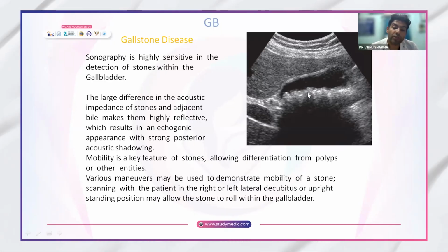So these are all gallstones which are within the gallbladder lumen, and these are mobile stones. So once you change the position of the patient, these stones also change their position. So again, a diagnostic point.